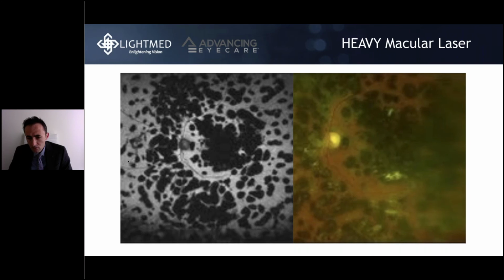I would say when we're talking focal laser or SP-Mode treatment in the macula, at least a month or two. I've had patients who come after like 4 weeks and I see a minimal response, but then I wait 4 more weeks, which is a total of 8 weeks after treatment, and then you see more improvement. So I would say sometimes you have to be a little bit patient and not rush into giving up on the treatment method that you've used, as long as the patient's vision is stable and they're not having worse complaints or worse vision than the previous visits.